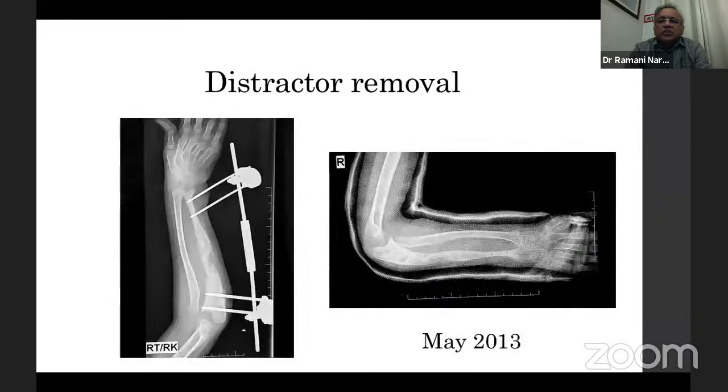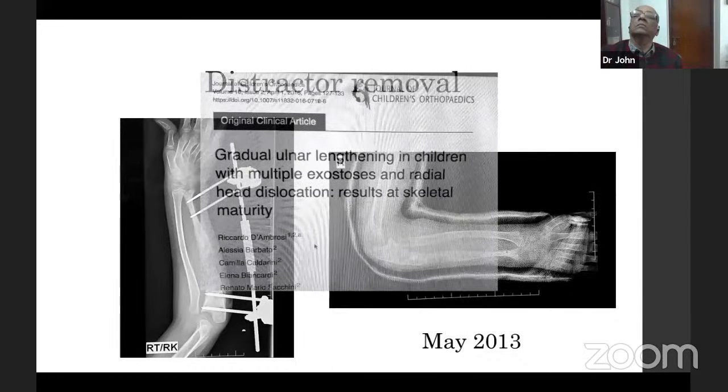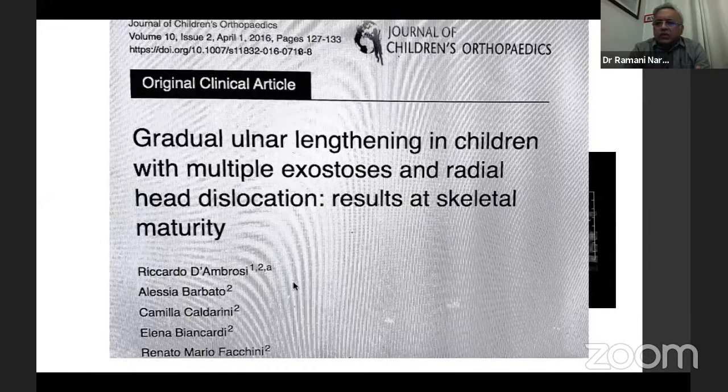Then we removed the distractor. And this is in May 2013. This is what it was. How old is the child now? The child at this point of time is around six, seven years. Now, take a similar scenario, multiple exostoses where the distal ulna is gone.